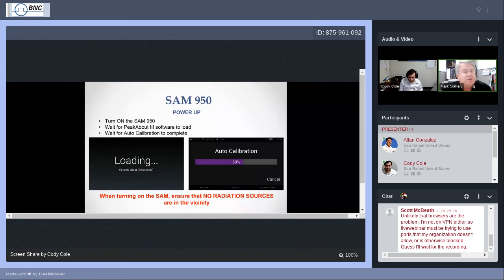The power switch on the back, with a little ring around it, will light up red. That lets you know that the device is turned on. On your screen, the loading screen message will eventually show. From a dead start, I think first you'll often see the Samsung insignia that you'll see on Android information on most smartphones. After that, you'll go to the loading. It takes about 40 seconds. We include that message so that you know you haven't done anything wrong. Expect about 40 seconds worth of loading.